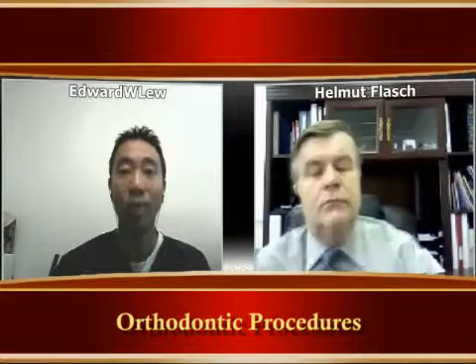We do it mainly on adults, but we do some on teens. For the first visit, if the teen is interested, we sit down with the parent and the teen, and we tell them, like you just said, if you want to do Invisalign, you would need to be very compliant. You would need to wear these. You would need to come see me every 2 weeks at least for the first months to follow it. And we give them a protocol to follow. And if they can follow this or agree to it, then most of the time it's a success, because we have to make sure beforehand that the patient understands what it takes to be successful with Invisalign.